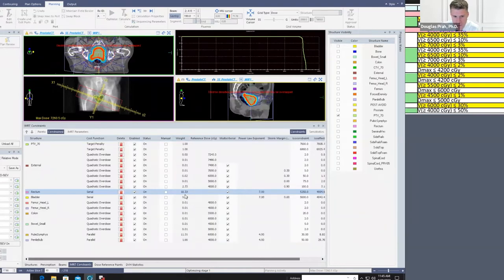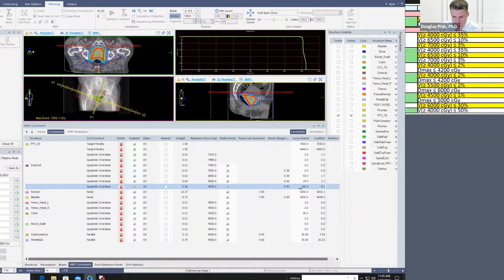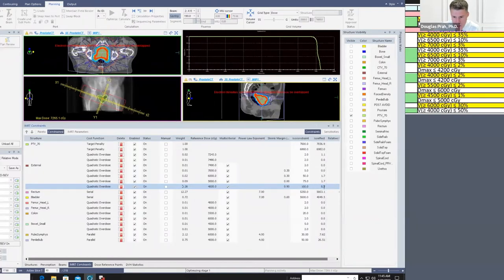The other one that it seems to be struggling with a little is this. But you can see there's actually a lot of room, this ISO effect here. So it's trying to get 100. It's currently achieving 8.2. But that's the impact of the MCO. So MCO is going to keep pushing constraints to see if it can squeak out a little more on some of these structures.